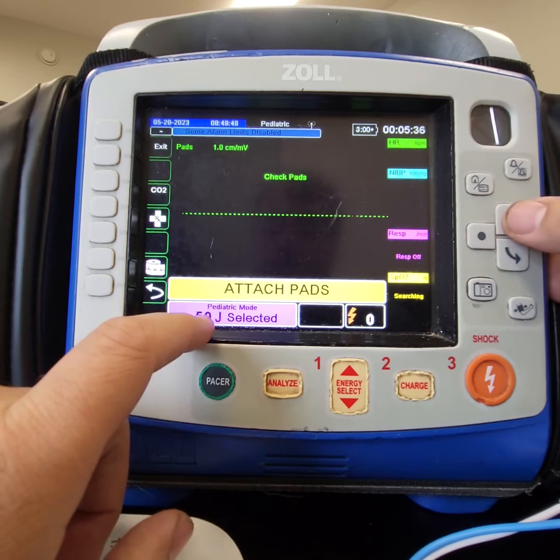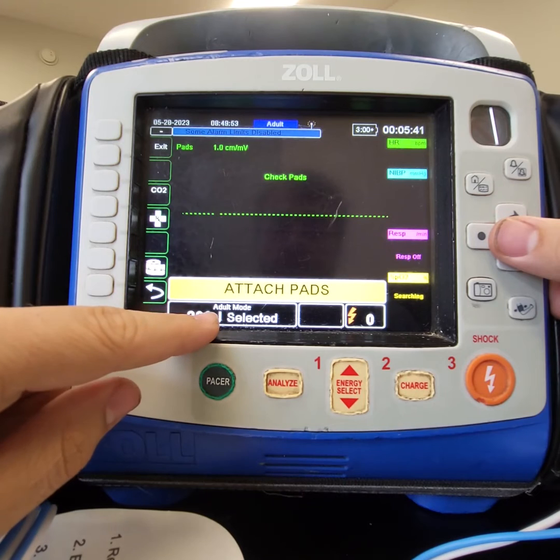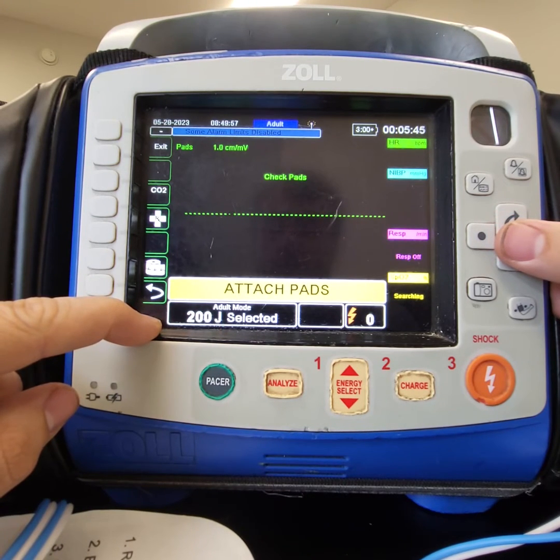If we were to change this back to adult, it says adult mode here and the correct amount of energy is selected.